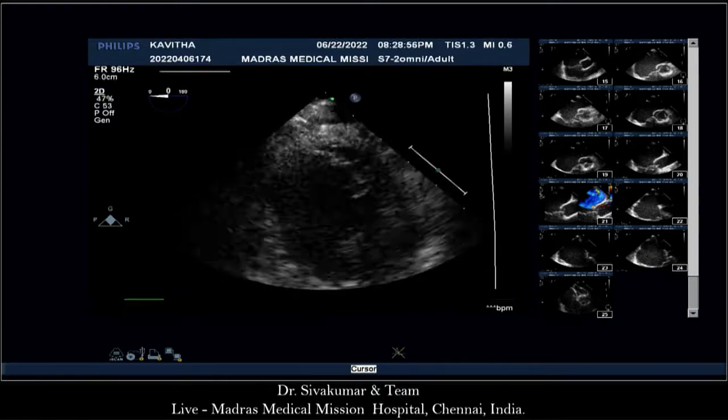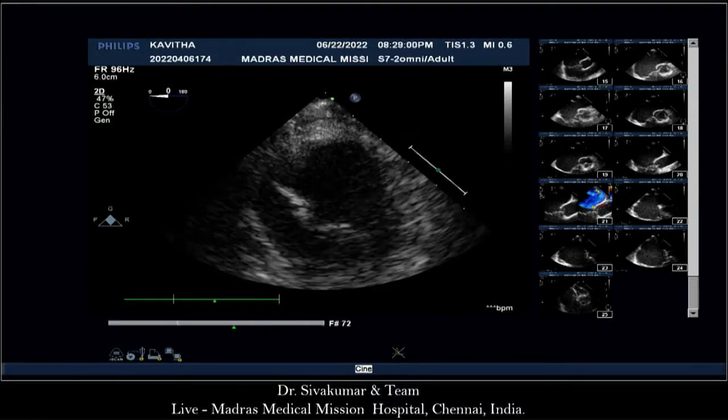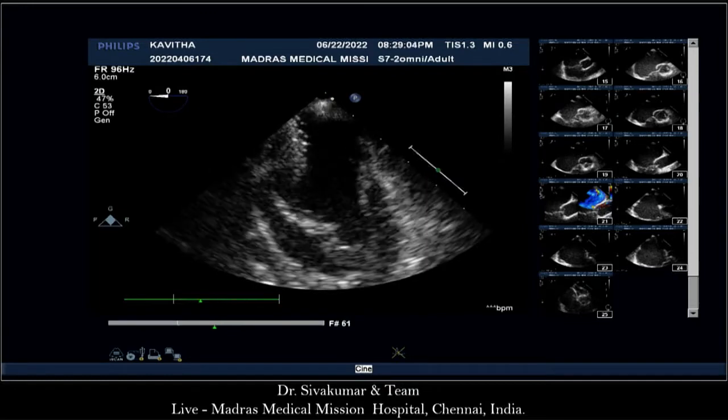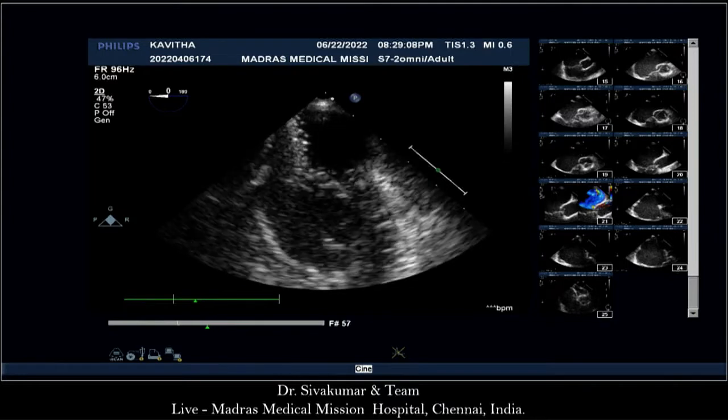We've got to look at this mitral valve very carefully. I'm not happy about it. I'll be honest with you. You can prove it, but I'm not. I think it's a very big device. It works. Hey, Peter, do you have a comment? See that mitral valve?